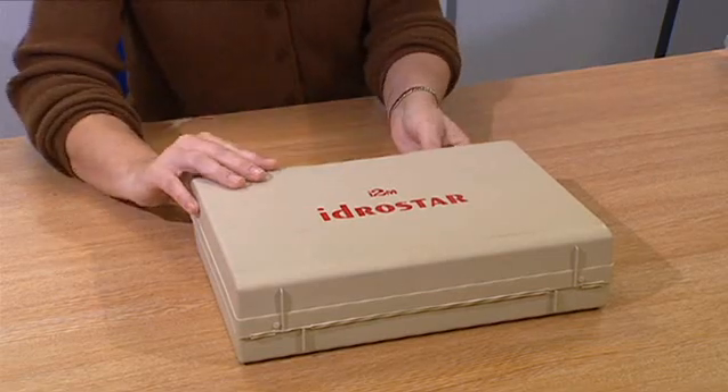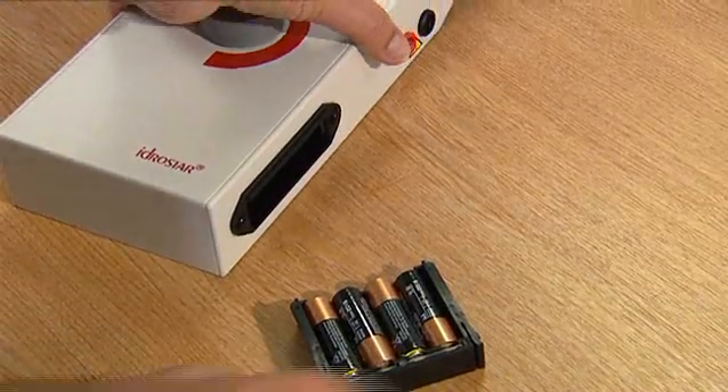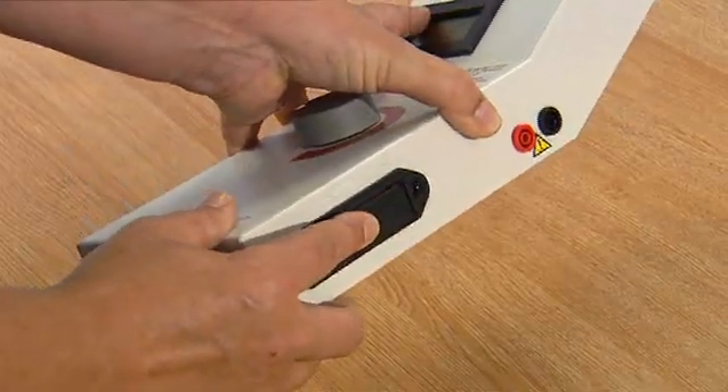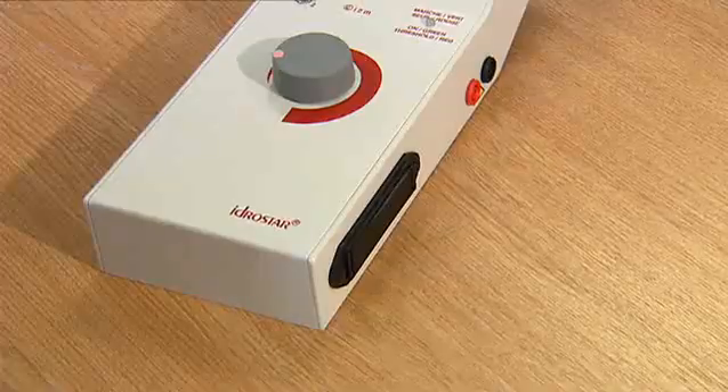Open the packaging and place 4 AA batteries into the battery compartment, ensuring these are fitted correctly. Good quality batteries are a must. You may use rechargeable batteries but do ensure they are fully charged before placing them in the machine.